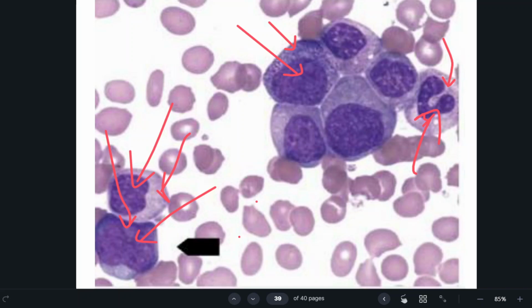What are these dwarf megakaryocytes? Normally megakaryocytes have a lobated nucleus and abundant granular cytoplasm. Only the ploidy increases, 4N, 6N, 8N, 16N, but the cell doesn't divide. So there is increased lobation of the nucleus as well as granular cytoplasm.